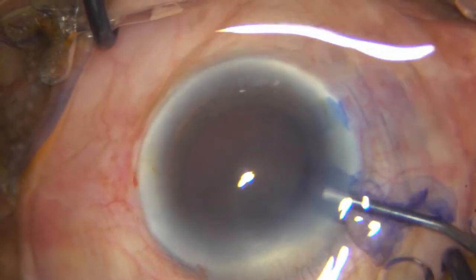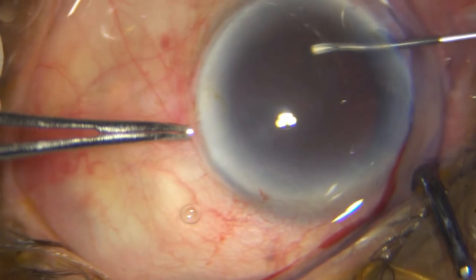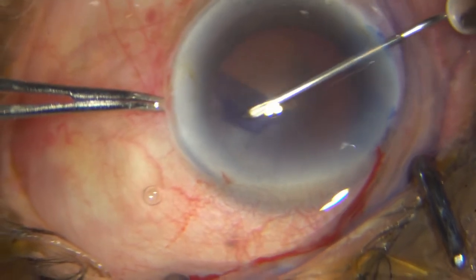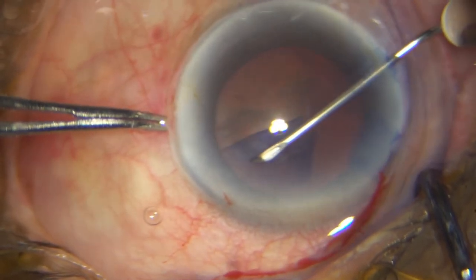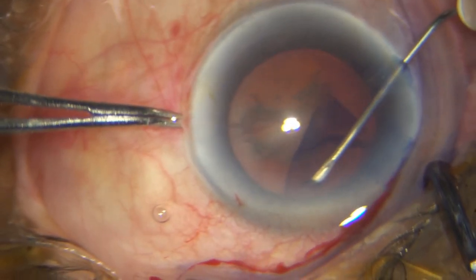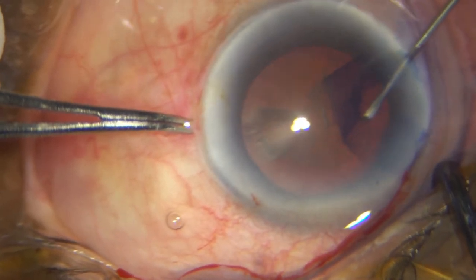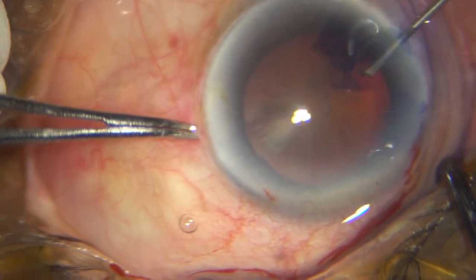I can already see that the pupil is not too well dilated — these are not good cases. I already know that this pupil is going to shut down on me. In these hard cataracts, everything has to go according to clockwork, because any step that goes wrong really sets up a cascade of effects that you wouldn't like to be faced with.